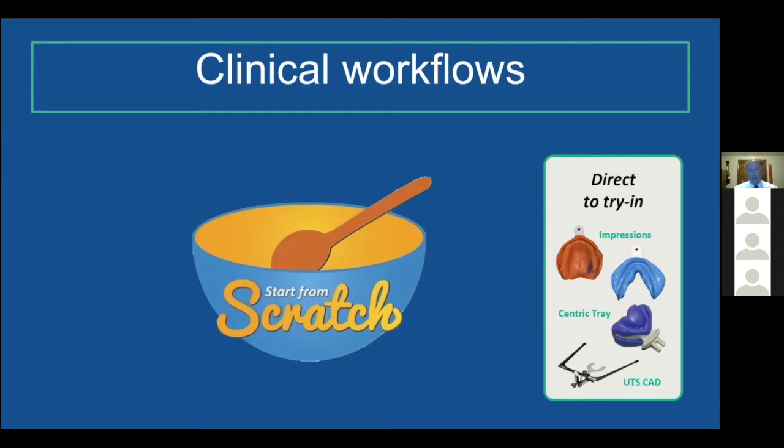So why would I deny myself that opportunity to work with this particular workflow? Well, on occasion the patient comes in, the dog got the dentures, they have no dentures, and you have to start from scratch. So this to me is my alternative workflow to not doing impressions in a duplicate of a patient's existing dentures. So let's talk about it.